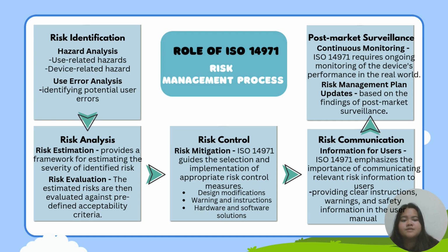Use-related hazards include inconsistent image quality, overheating of the transducer, and others. In device-related hazards, mechanical failures and material degradation may occur. For use error analysis, this standard emphasizes identifying potential user errors and their consequences.